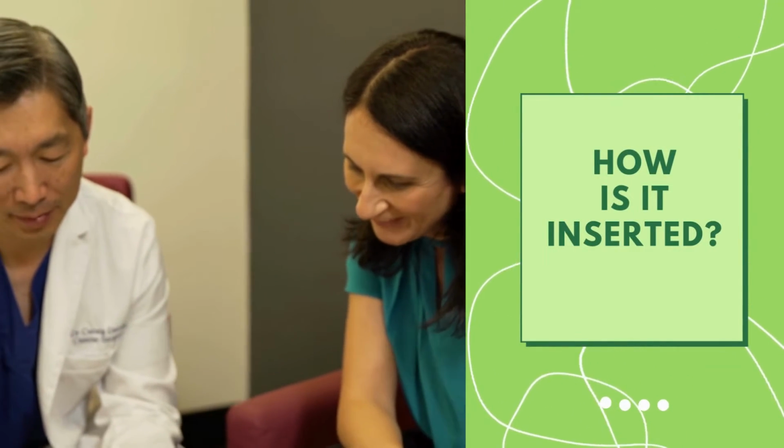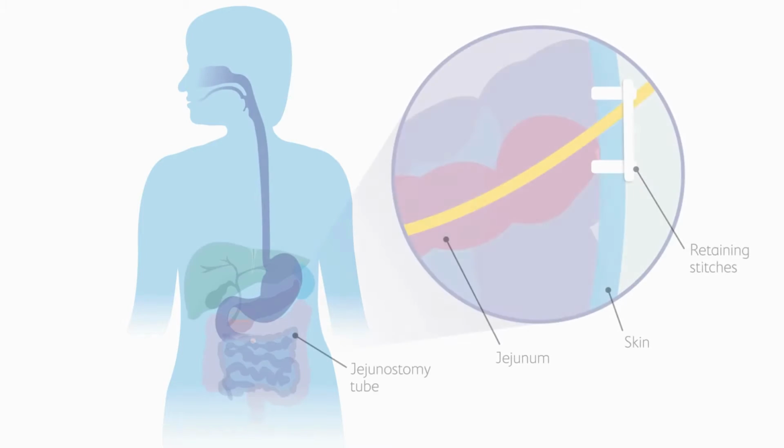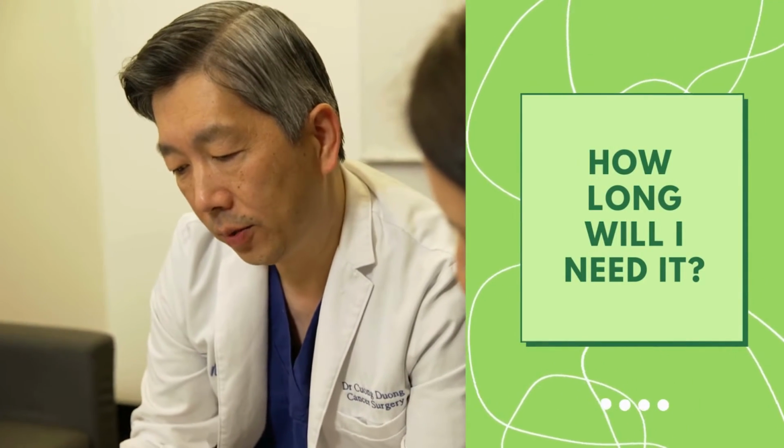A feeding jejunostomy tube, often referred to as a Jej tube, is when a tube has been inserted from outside the body into the bowel to allow us to give the patient nutrition. This tube often stays in for 6 to 8 weeks following a major surgery such as esophagectomy.